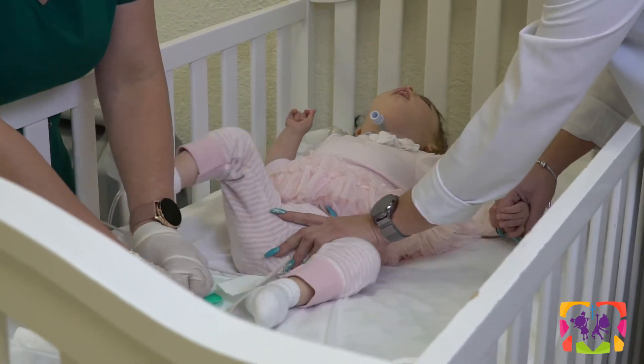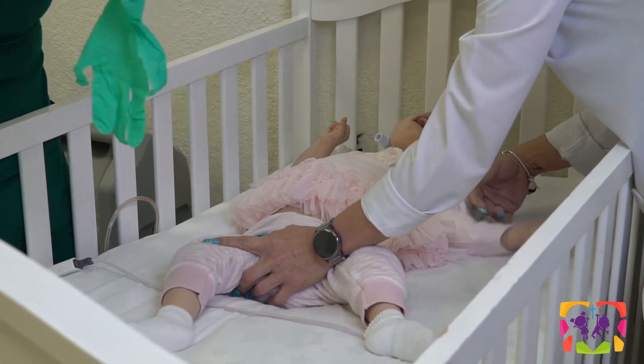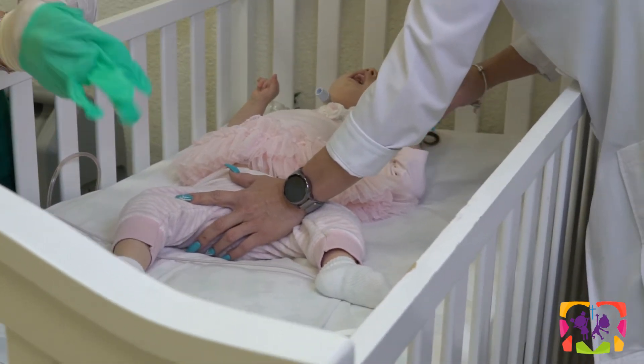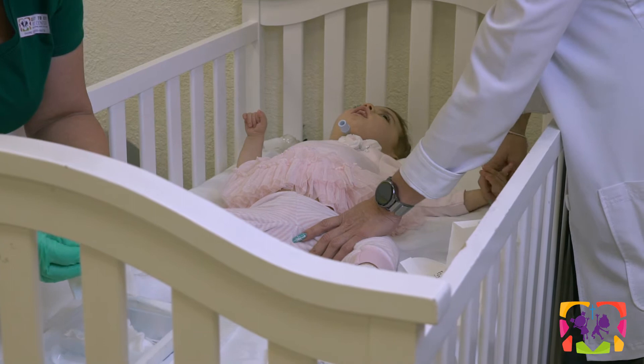The nurse is going to don sterile gloves now. Next, you're going to wet the gauze so that you can clean around the area with the sterile saline.